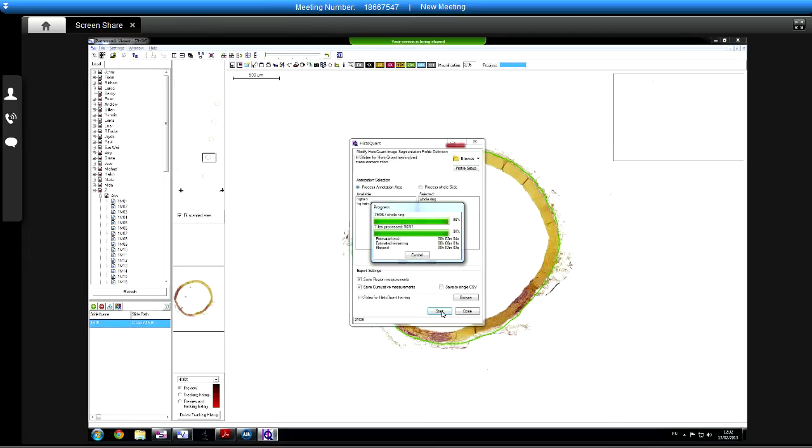Not nice noises, but it doesn't jam, right? Occasionally it might. It has snapped one off a slide before now. Generally, it's if I've missed a big blob of mountant or something. Time to worry is if you can't find a reason for it doing it. If you look at it and you go, oh, the cover slip's half off, something like that, then that's normally the reason.